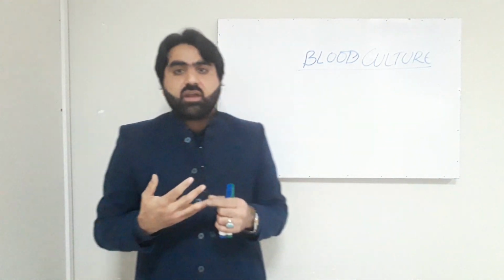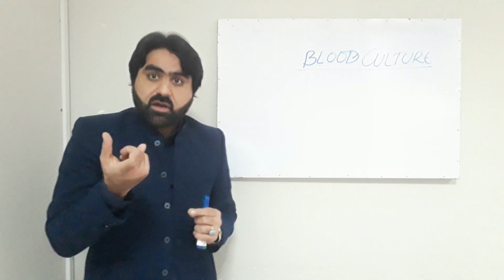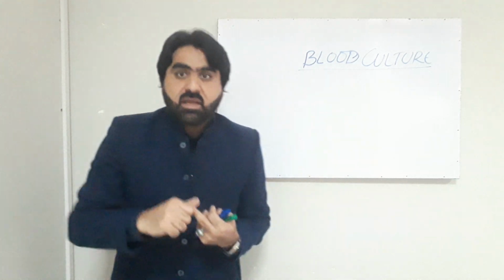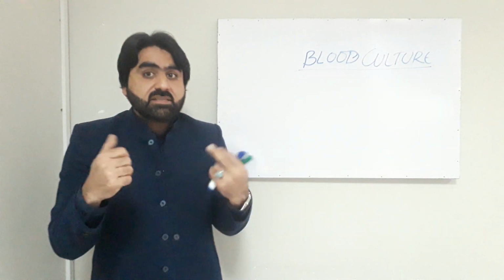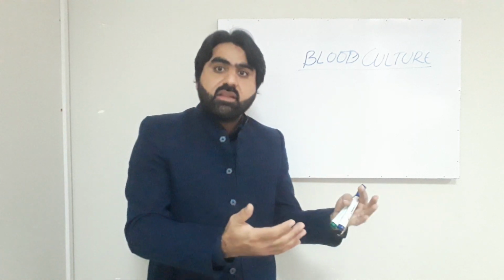The second importance is that through blood culture we can isolate a particular pathogen and identify that pathogen. The third importance is that we can check that pathogen for antibiotic or antimicrobial resistance and sensitivity in order to optimize the antimicrobial therapy of that patient.